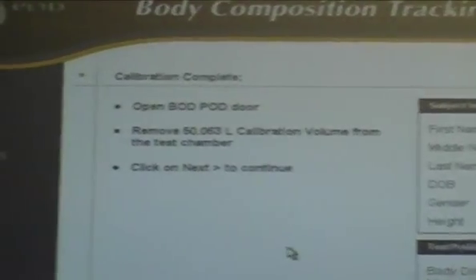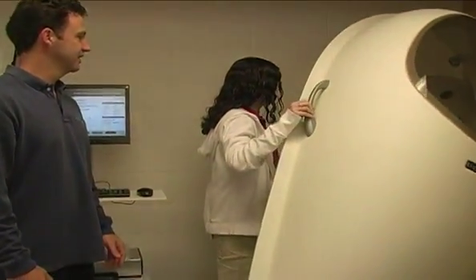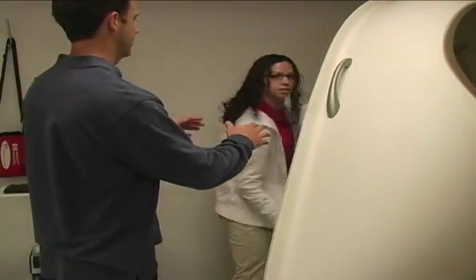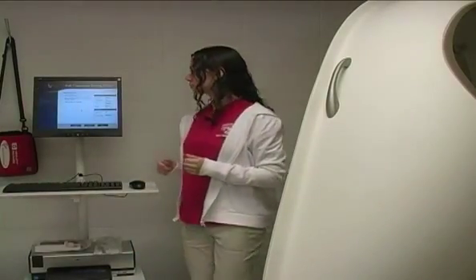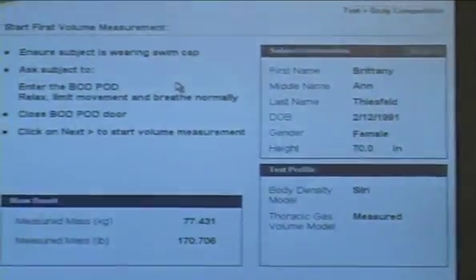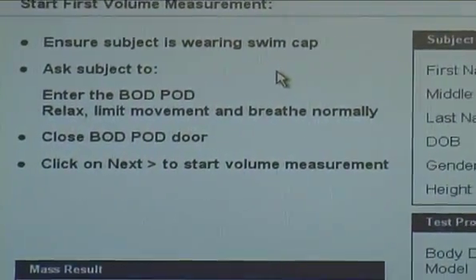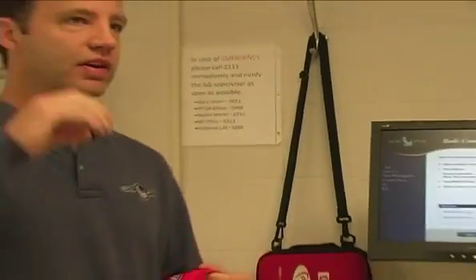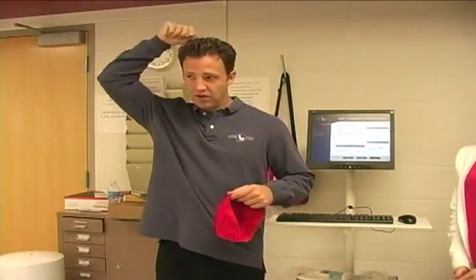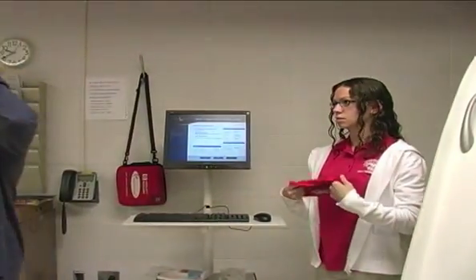Okay, so what does it say? It says open the BOD pod door, remove the cylinder, and click next, because you're not going to get in there with the cylinder. You don't have to put it on your lap. So, again, this tells you what to do. Ensure they're wearing a cap. Because the hair traps air, you want to compress the hair. So that's why we have you wear a cap. Typically, with females, I think, have it in a ponytail and then wrap it underneath. This stretches, and just try to get as much hair as possible underneath the cap. Some people have it over the ears, some people's ears are out. That doesn't matter. What you want is the hair inside. So have her put on the cap.